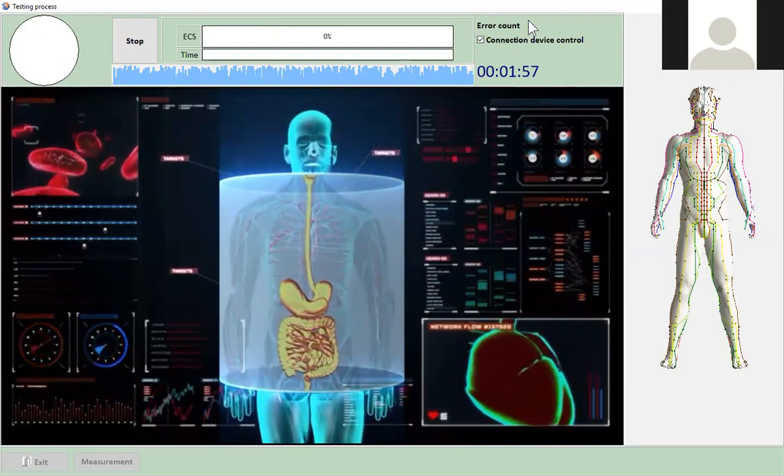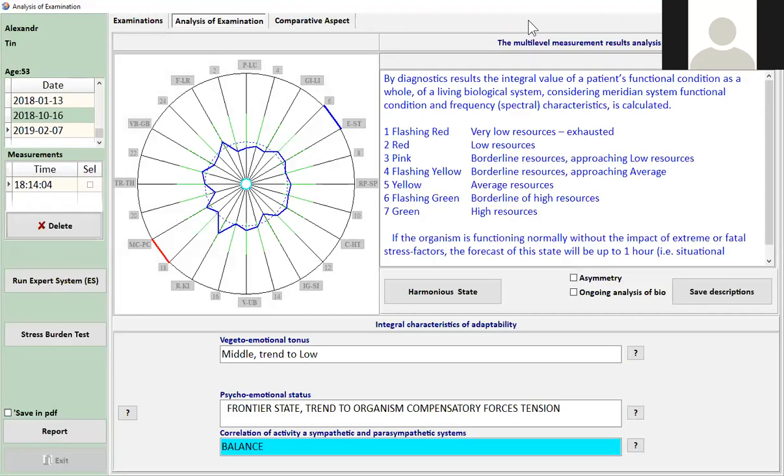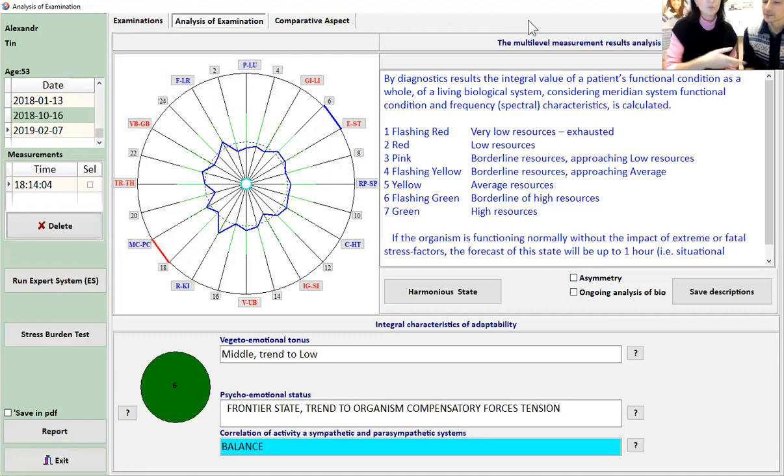So that green line across the top where it says time, that's the iteration sections or whatever it was called? Yeah, the green one is just the time, but the red one is his energy production.